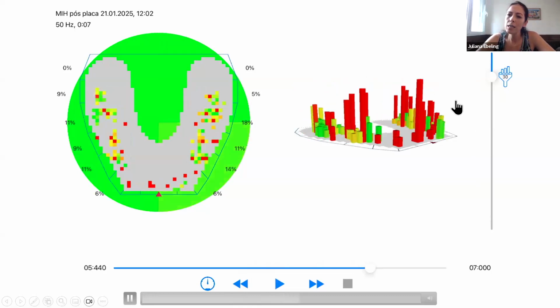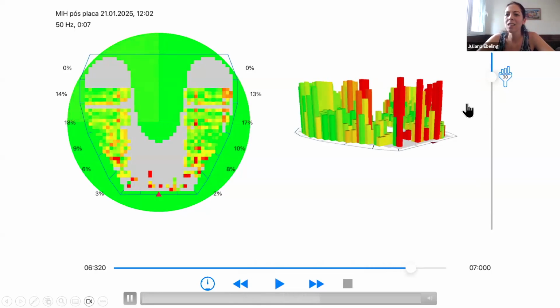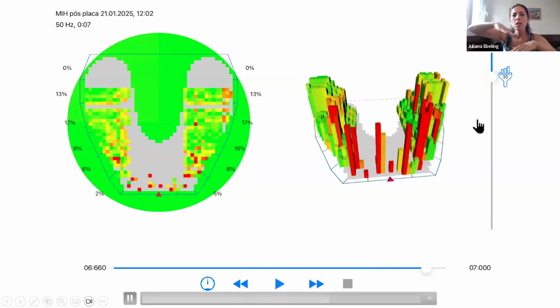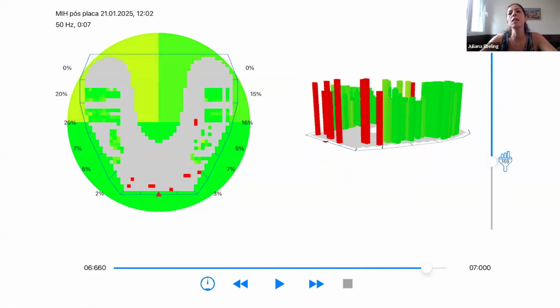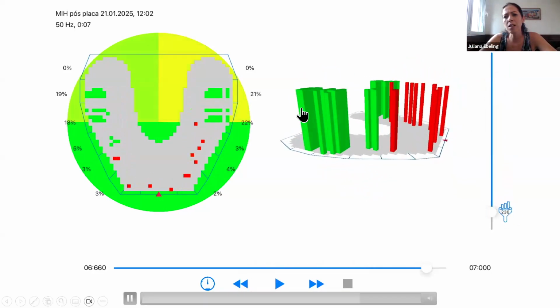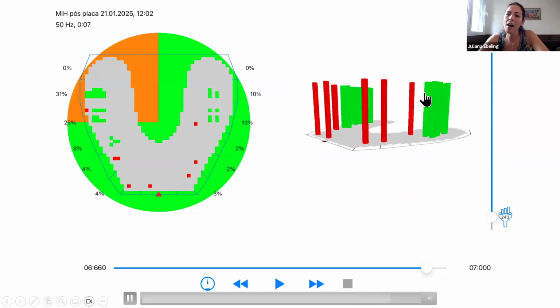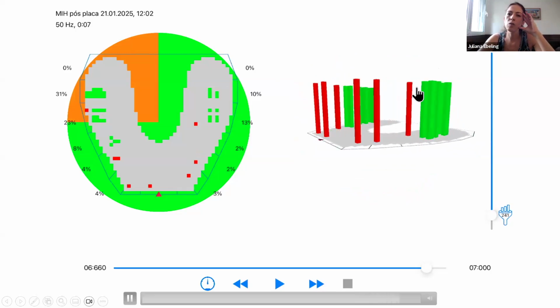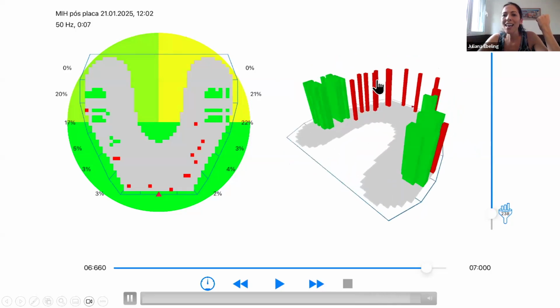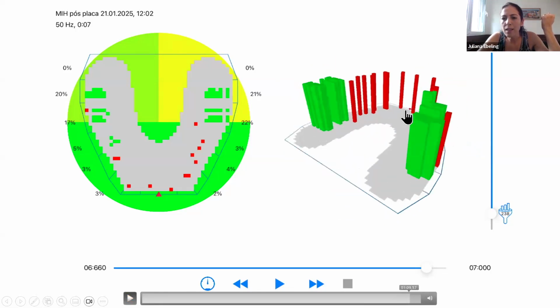Look how we have the distribution. Look that the contacts don't happen in the same way, at the same time. The patient needs muscle activity to reach that. And look, when I filter the data, look how it really corresponds with what we have in the occlusogram from the scanner. And here we have the specific information about the intensity.